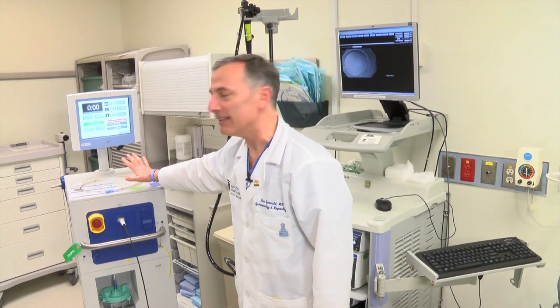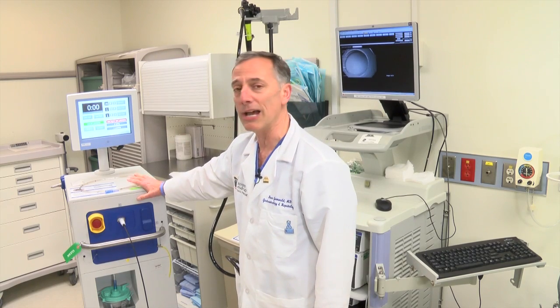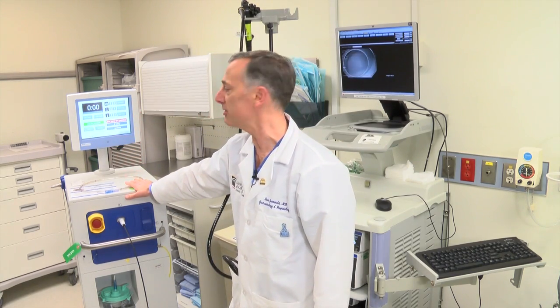My colleague and co-author, Dr. Bruce Greenwald, will provide a demonstration of the spray cryotherapy procedure. I'm Dr. Bruce Greenwald, and I'm going to demonstrate liquid nitrogen spray cryotherapy. This is the liquid nitrogen spray cryotherapy device called TrueFreeze by CSA Medical. It contains a tank of medical-grade liquid nitrogen at minus 196 degrees Celsius and the control mechanisms to allow a low-pressure spray to be delivered through a catheter. The control panel is here where we measure and monitor the flow of liquid nitrogen.